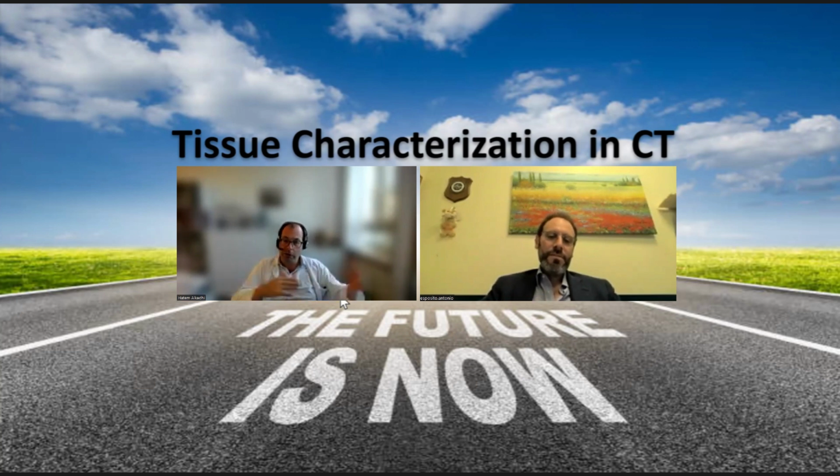They say, look, let's rule out CAD with CT, and then at some point we get an MR, or we go without MR and have the diagnosis perimyocarditis. And this is always when I think, it would have been optimal to have your protocol in our emergency department. We do a CT, and we can at the same time rule out PE or aortic dissection whatsoever. And when there is nothing at the coronaries, wait 5 to 7 minutes, do the late enhancement scan, and look if you can detect or rule out. I don't know if this is possible, but at least rule in perimyocarditis.